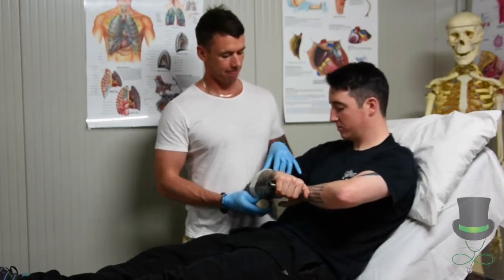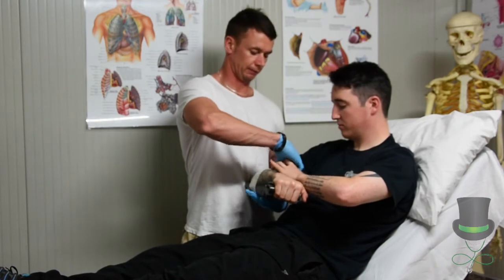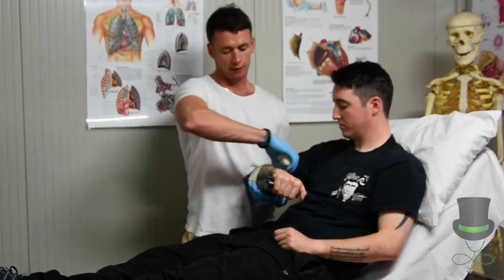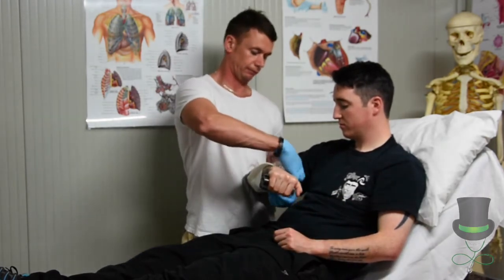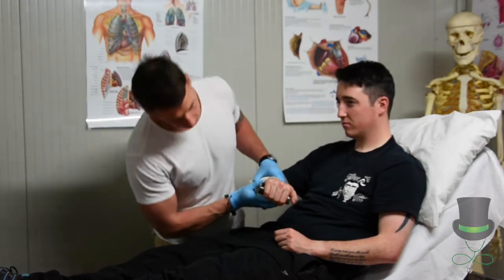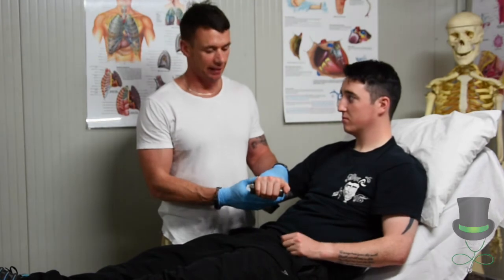We then get a crepe bandage, remove it from the packaging. Place your finger here for me and wrap the crepe bandage around the SAM splint. When you're happy that the SAM splint is in place and it's providing enough support for the patient, we then must carry out CSNs again.